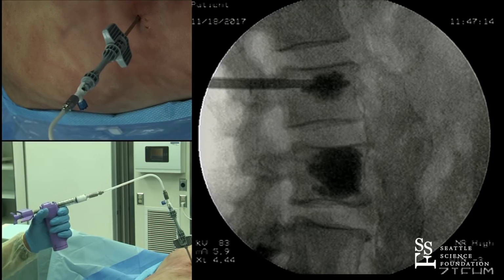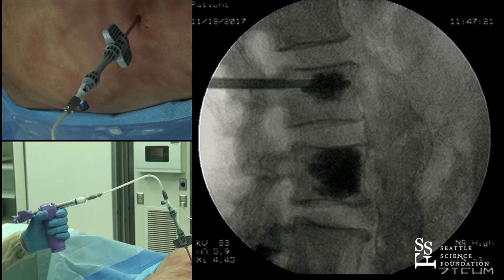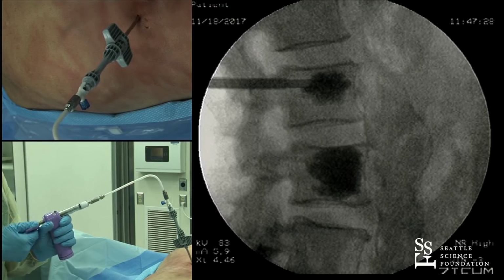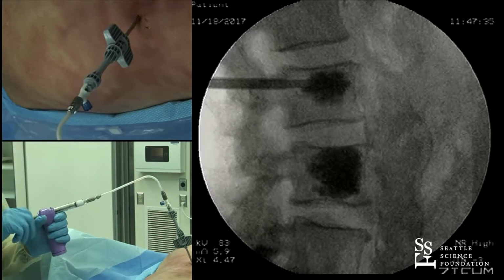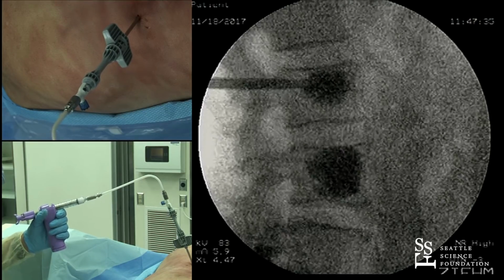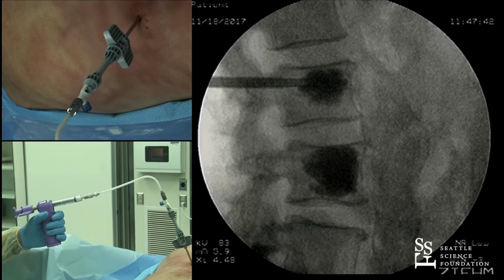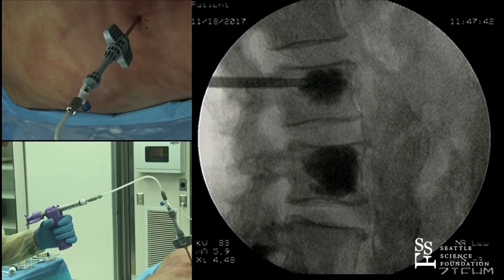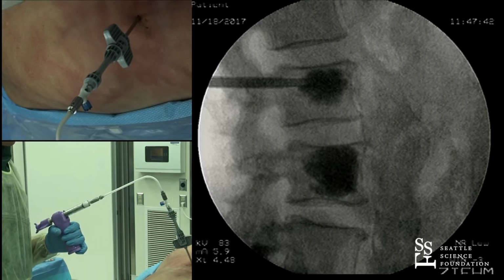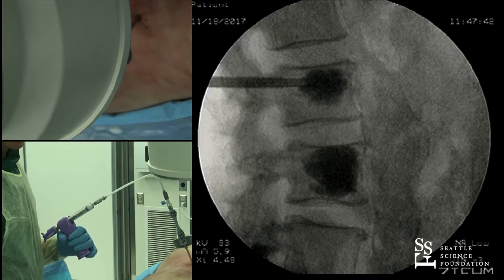And because of the presence of the coil, you don't need as much cement. The difference between this and another technique involving balloons or this garden variety straight vertebroplasty is you don't need as much cement because the implant is space occupying. Okay, with that, I'd like to get a shot AP and see how we're doing. The presence of the implant itself was one of the reasons why the cement amount was less, because it takes up about 2.4 milliliters of cement. Displacement is about what the implant would account for.